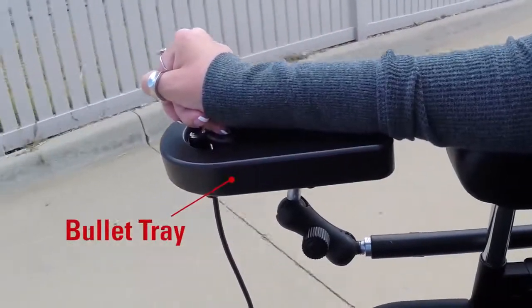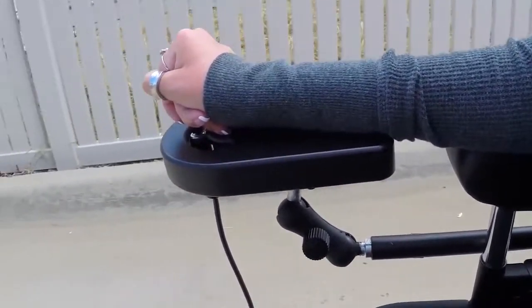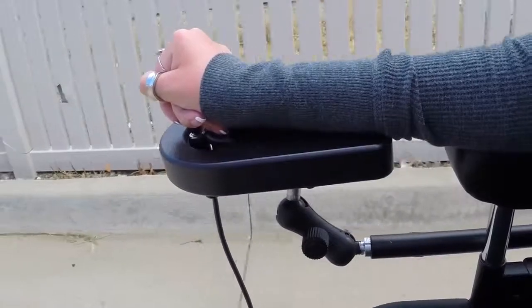The bullet tray is intended to support the user's hand while driving with the MicroPilot or MicroGuide joysticks.